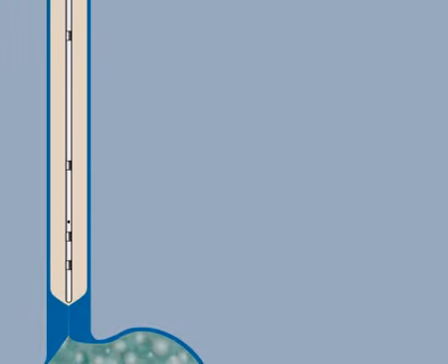To improve the measurement technique, we add rings to the catheter. Between the two rings, the impedance is measured. In rest, the measured impedance reflects the impedance of the esophageal mucosa.